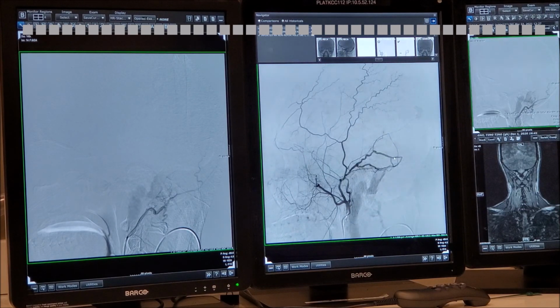It looks like my experience of using microwires is very limited, obviously. But it looks big enough for me to get closer to the fistula point. Okay, so what catheter would you use? You decide to treat it. Yeah, I would not treat it.